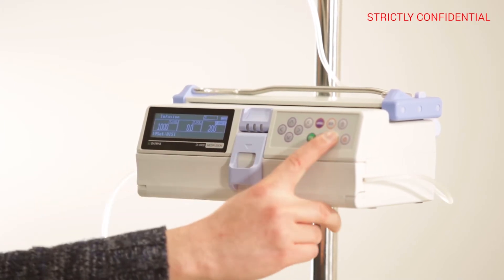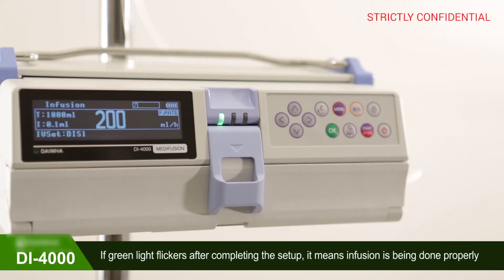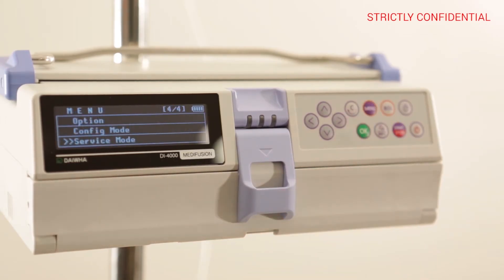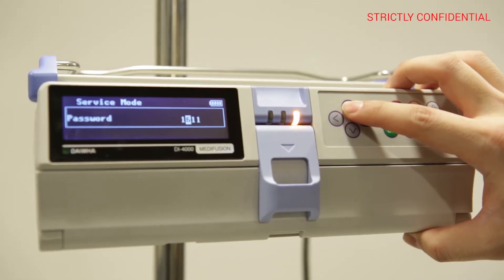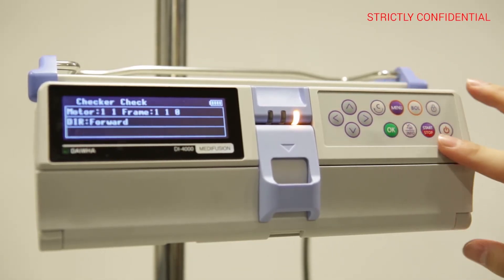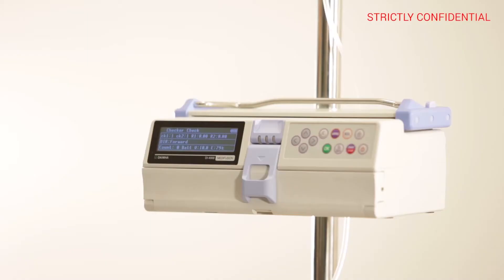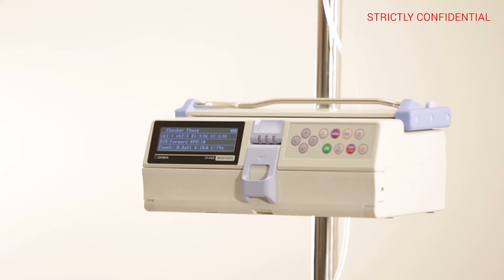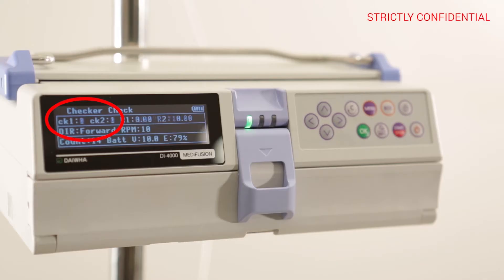After loading, close the door and press the start button. When an error message appears, press the menu button and enter service mode, inputting 1711 as the password. Use the arrow keys to enter the checker, press the star key, and check if the values of CK1 and CK2 change between 0 and 1 frequently in alternation.